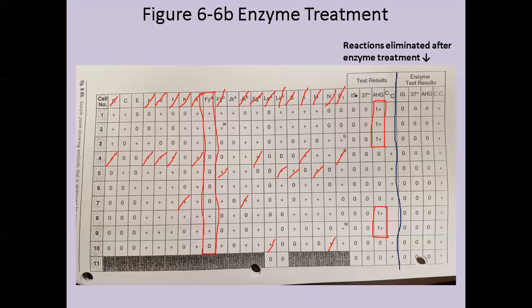We're still going to look at our last one, JKA. Positive, positive, positive, positive, but then negative, patient's reacting. Then we have 1, 2, 3 antigen positive cells that patient didn't react with. This fits down here. It's really not a complete match, but some of the patterns are matching, and so it's not a perfect match.